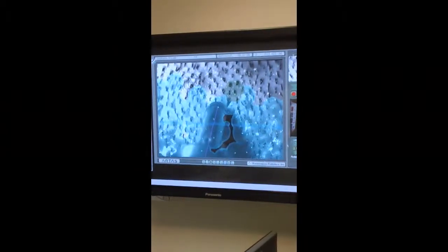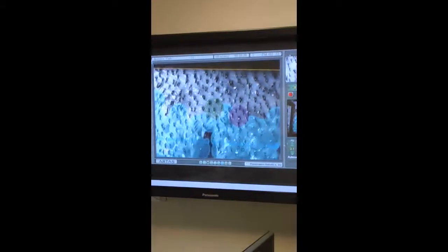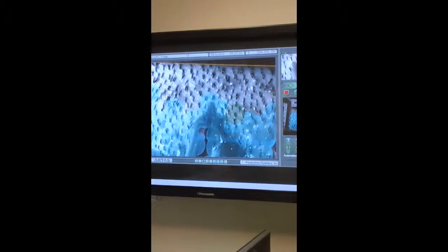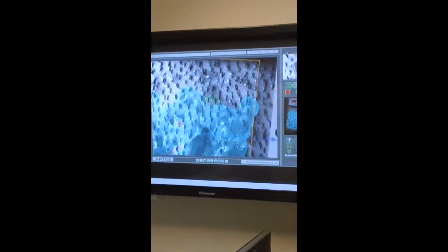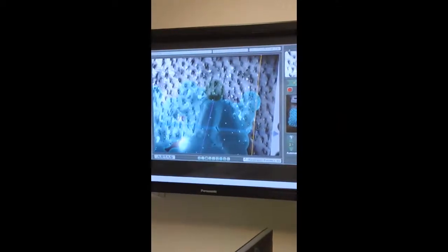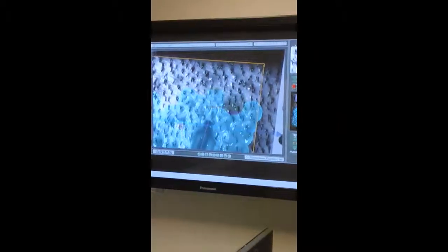If you see the screen there, it looks great. So far so good, and we'll update you as we go. Thank you.